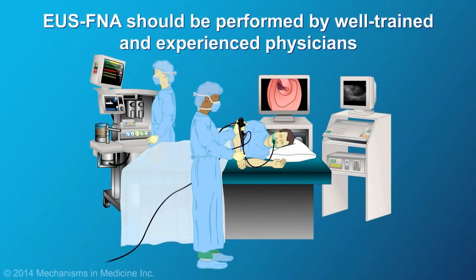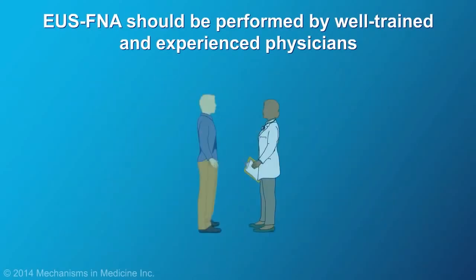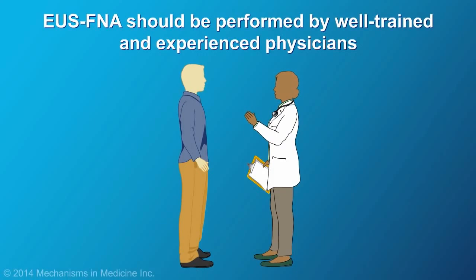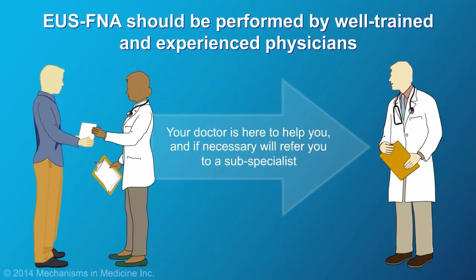EUS-FNA is an advanced endoscopic procedure that should be performed by well-trained and experienced physicians. You should not hesitate to ask your doctor about how much experience they have performing EUS-FNA. Your doctor is here to help you, and if necessary, will refer you to a subspecialist.